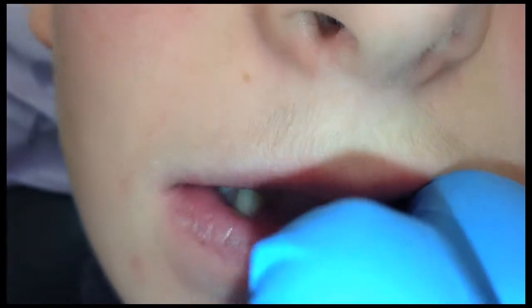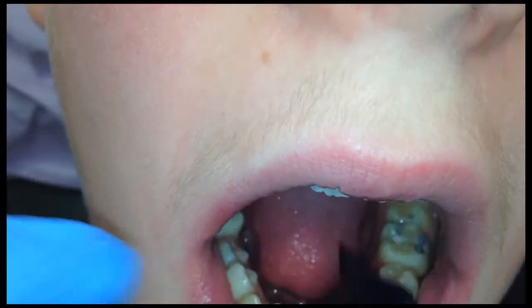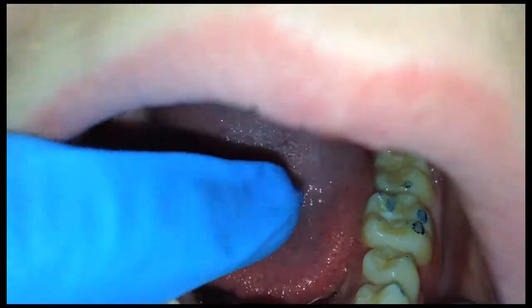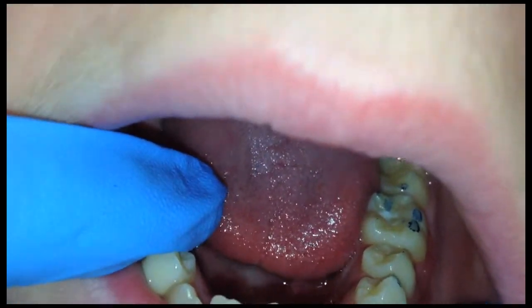Check the occlusion to ensure that there are not excessive high areas. We use an unfilled sealant material that wears easily, so occlusal adjustment is unnecessary.